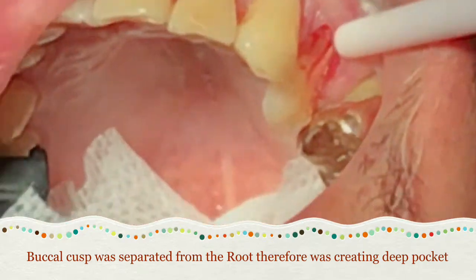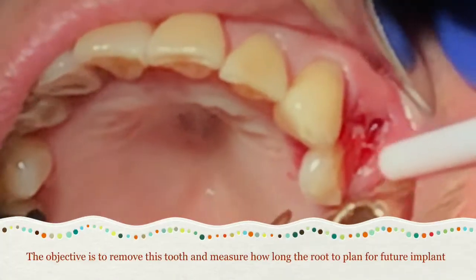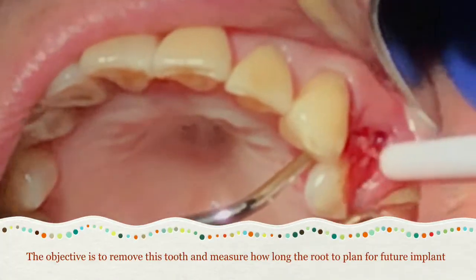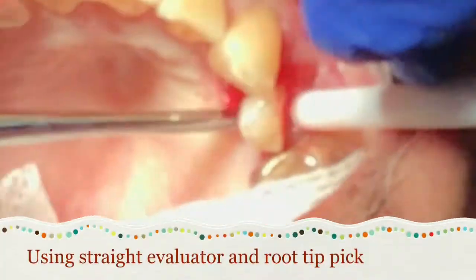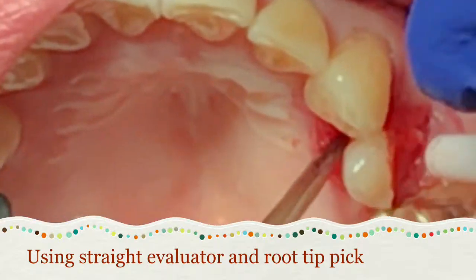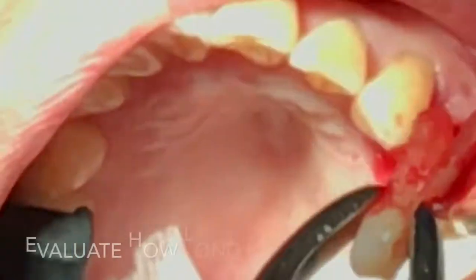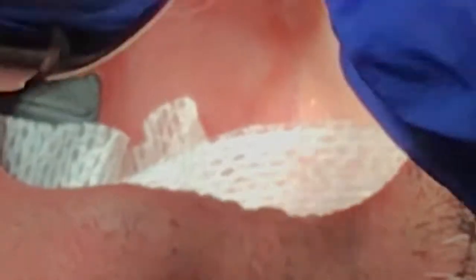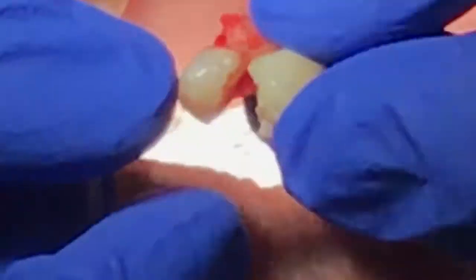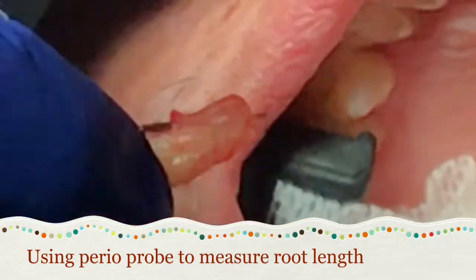The next thing I want to talk about is: once you take out the tooth, especially toward the front or back, if you plan to do an implant, your goal is to take out the tooth in one piece so you can measure how deep the root is and determine what implant size you can place next time. In this case I use the perio probe.